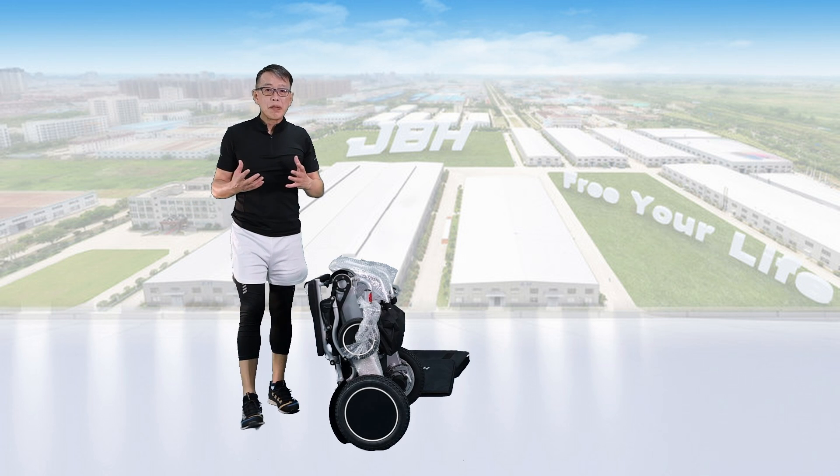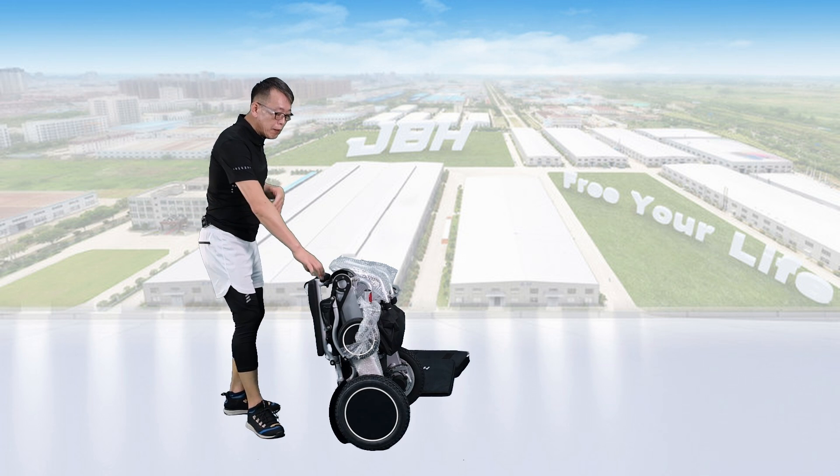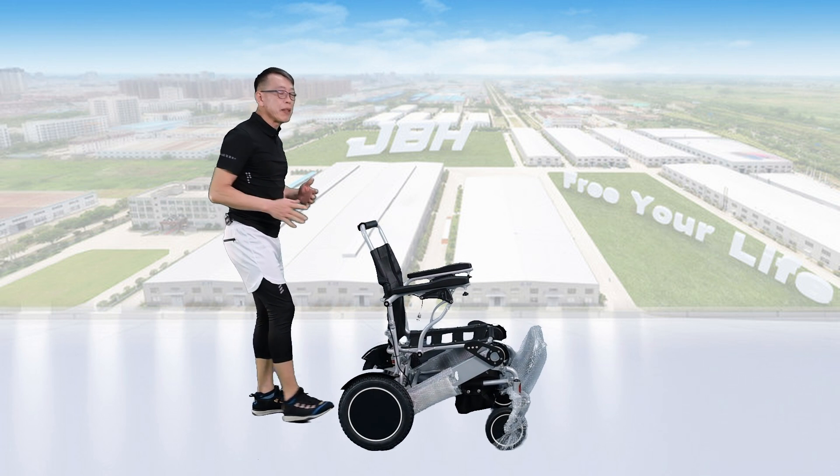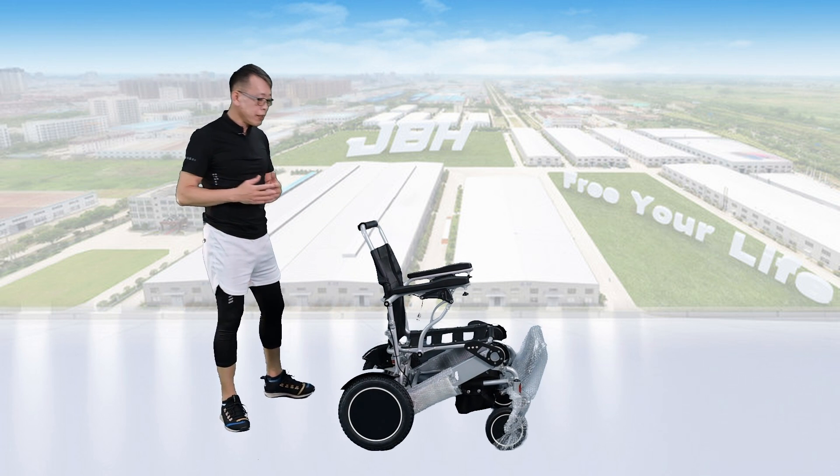Once we take out the wheelchair from the carton, we just hold the top here and then lean towards the front so that you can open up the wheelchair in just one second.